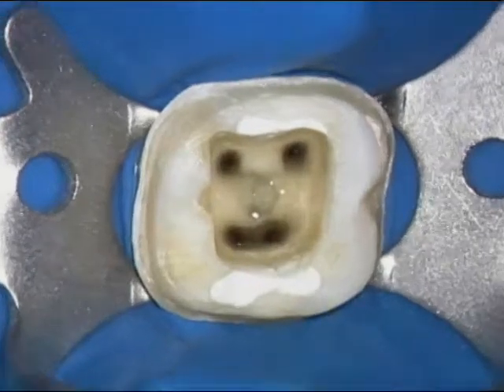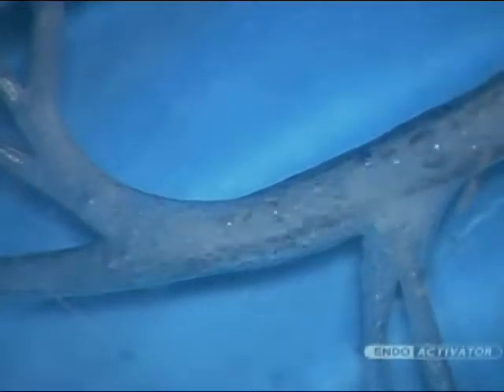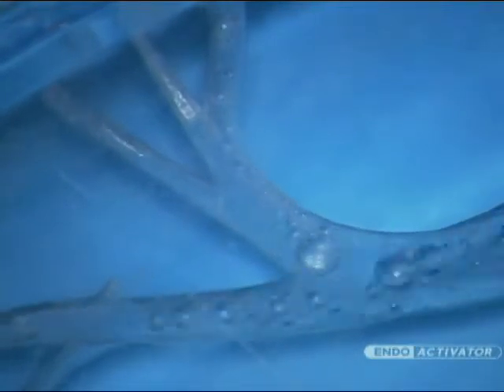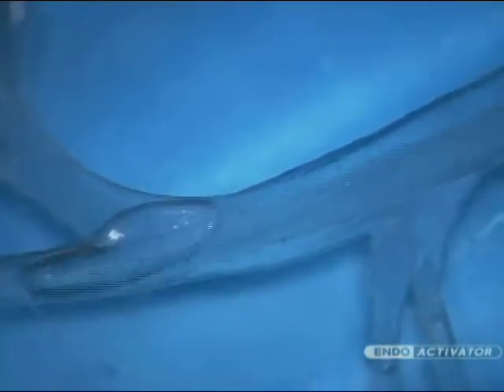To better appreciate the hydrodynamic phenomenon below the orifice, let's look at a simulated root canal system. A vibrating tip generates intracanal waves. Random waves create a negative pressure that causes a liquid to fracture. Bubbles are generated that expand and become unstable, then collapse in what is termed an implosion.